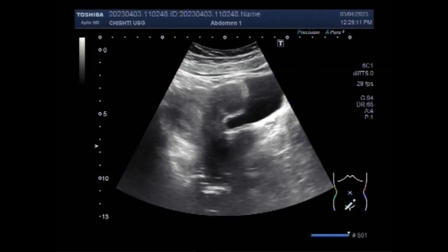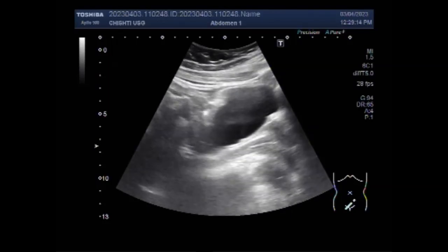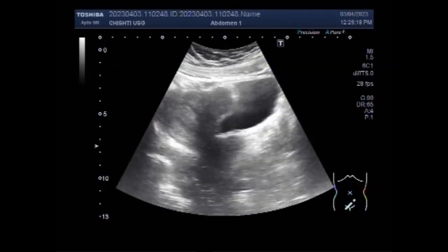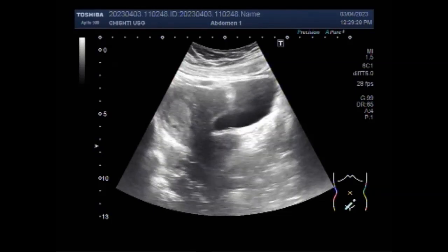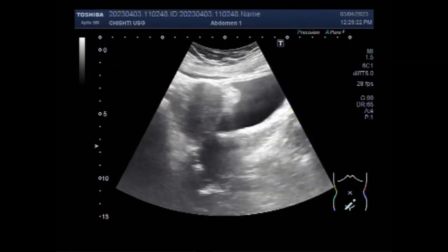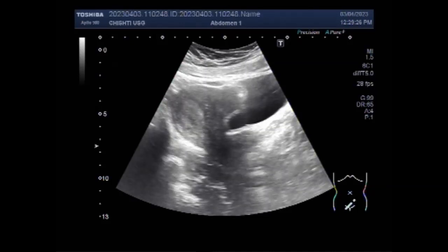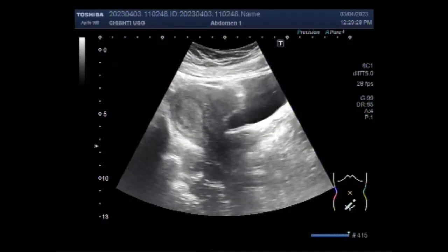Dear viewers, I hope you are all fine. This ultrasound video shows a case of uterine polyp with anterior wall fibroid. You can see the uterus having a uterine polyp in the distal portion of the uterine cavity, and an anterior wall fibroid is seen attached to the distal portion of the anterior wall of the uterus.